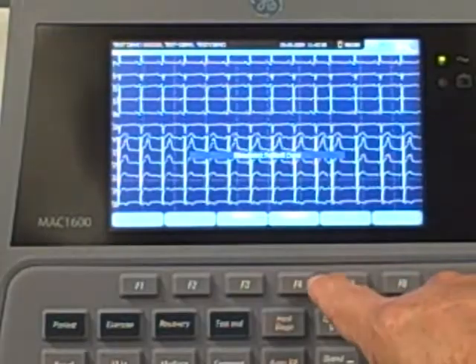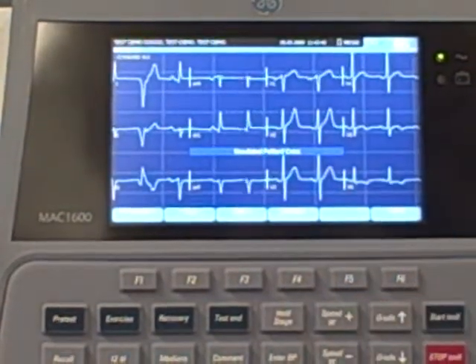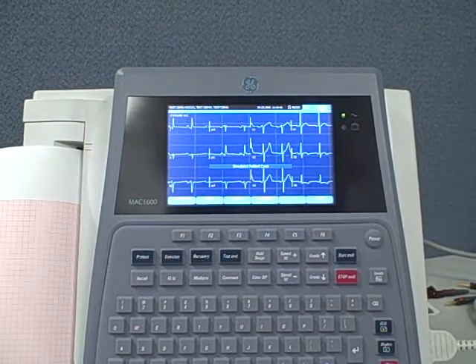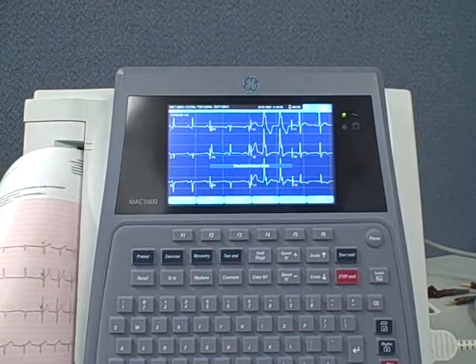Now let's take a closer look at the screen. One touch operation, all 12 leads represented on the screen, which is pretty unusual in most machines. And your EKG comes right out.